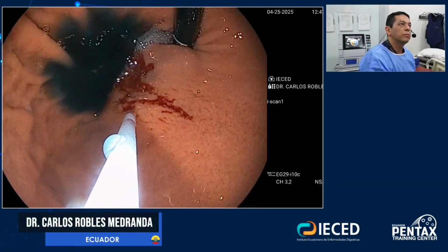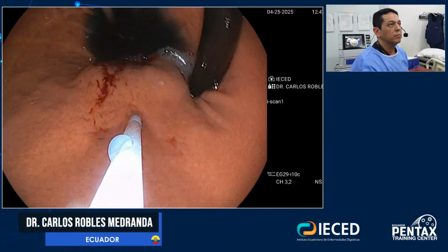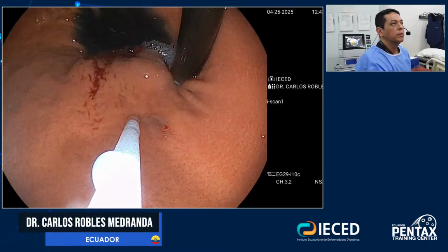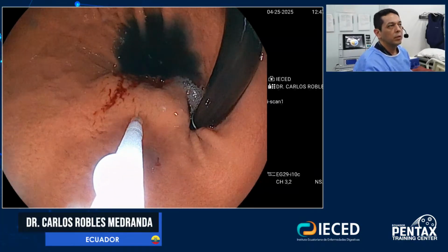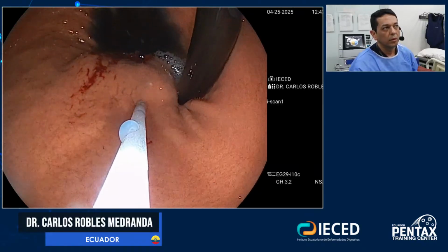Now I need to go to this area. Okay. Abre. Un momento. Inyecta.